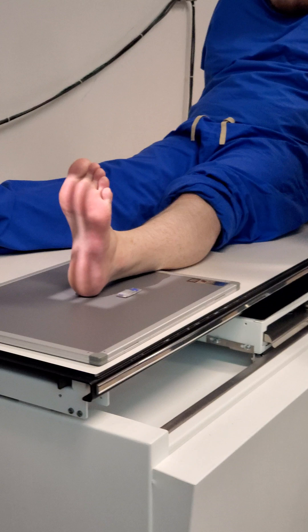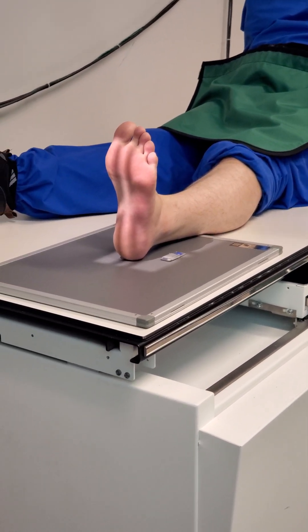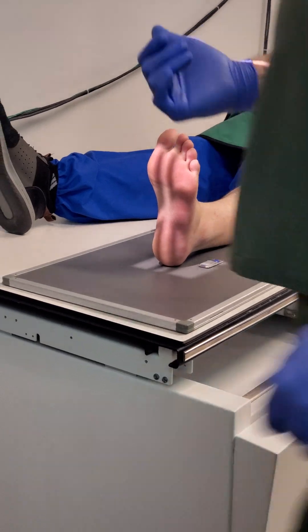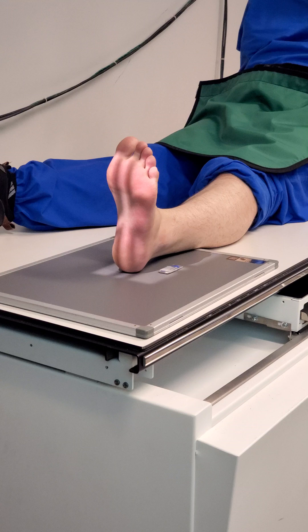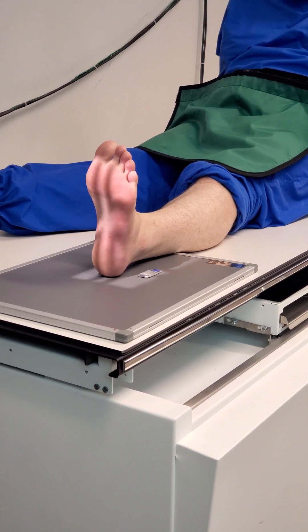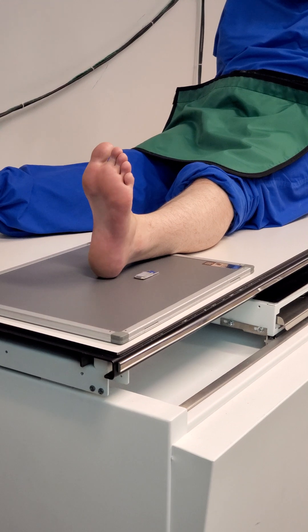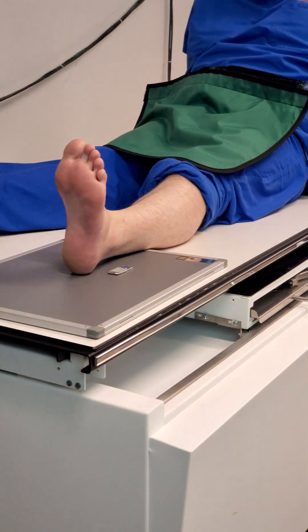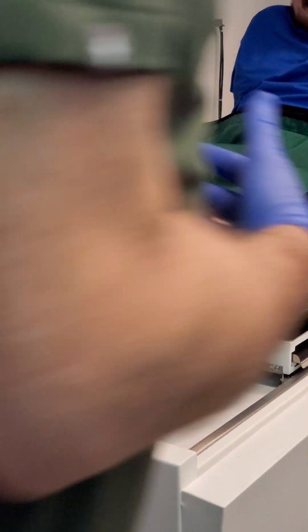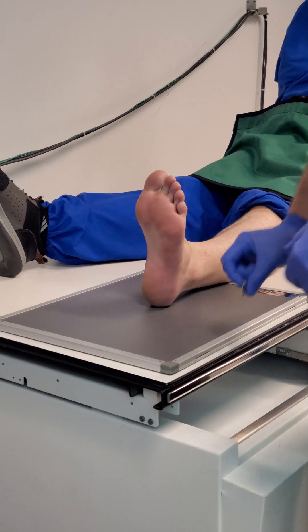Be sure your patient is shielded, especially since we are angling cephalic. Is there any breathing instructions or anything we need to tell them? Be still, don't move. Don't leave your patient like this too long — they'll start to get a cramp. That's your first exposure. Any questions on that one?